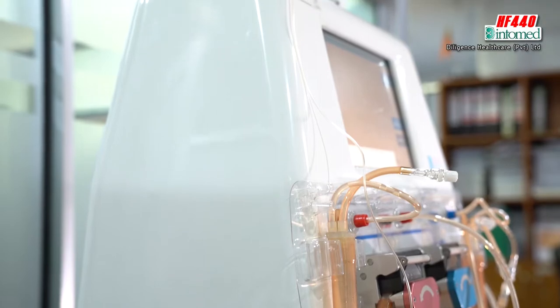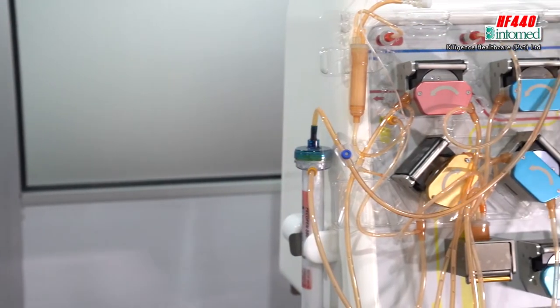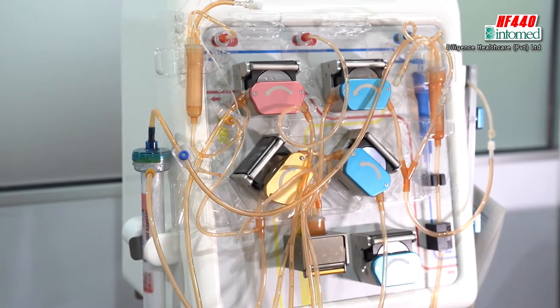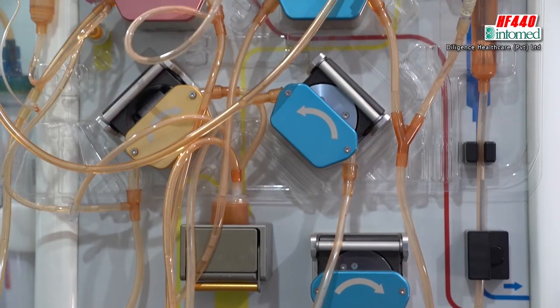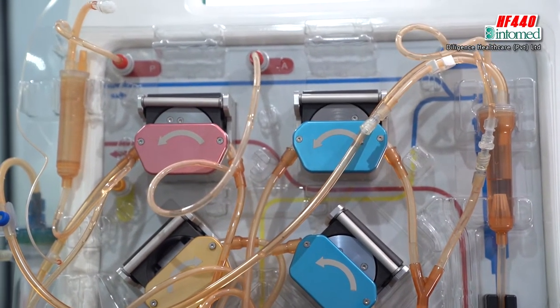When the blood is almost about to go out of the venous line, you have to stop the blood pump and take the venous line and connect to the patient again. Now both the arterial line and the venous line are on the patient, and you have to start the blood pump.